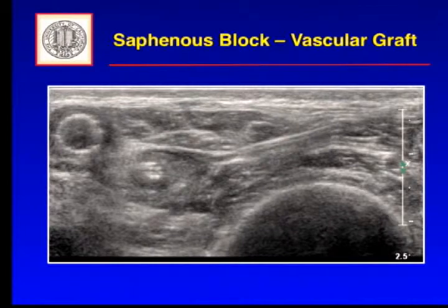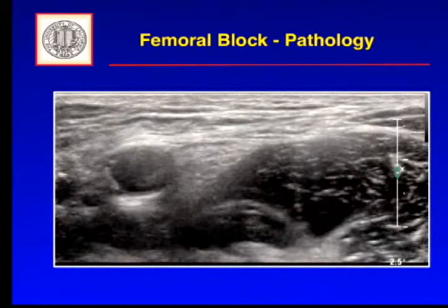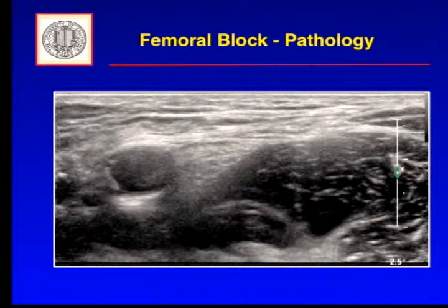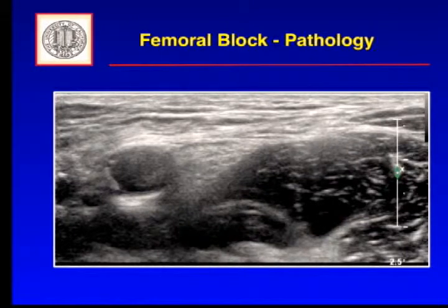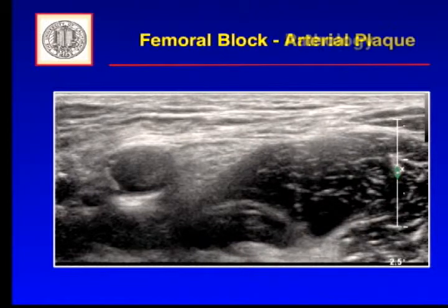Here's a femoral nerve block. You can see the femoral artery, femoral nerve, skin surface here, and we heard a lot about posterior acoustic enhancement that occurs deep to vessels. In this case it's arterial plaque — you can see plaque on the wall. There may be implications for post-operative anticoagulation and management of those patients. You'll see this a fair bit.